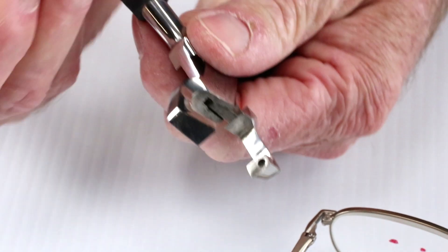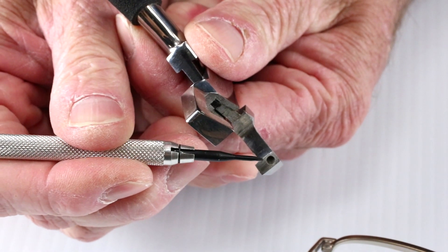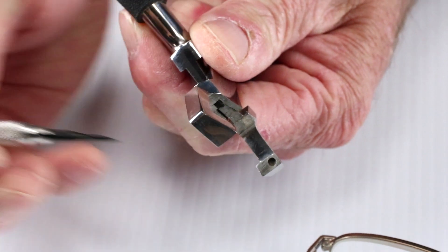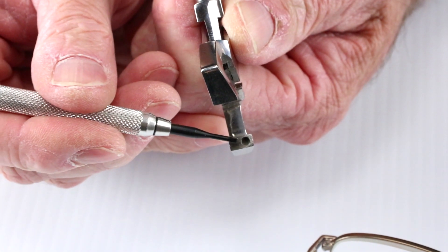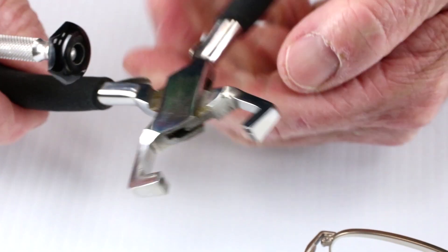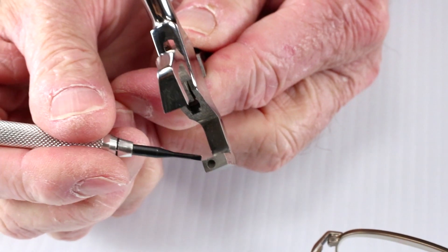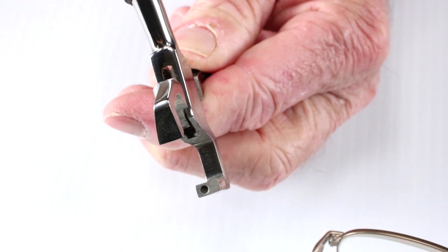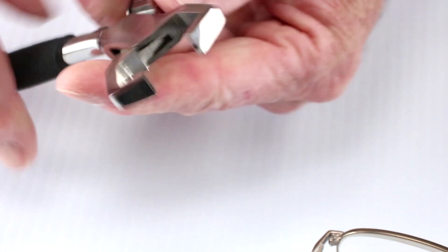Here is what makes this plier special. First, notice the relief holes. They are there to avoid damage and increase contact area. Should a frame have a raised screw head or a protruding screw end, the plier head will clear them and grab the frame. Second, notice the large contact area. This is there to distribute the force being applied to as large an area as possible. This reduces slipping and it concentrates the force so that the bend is where you need it.